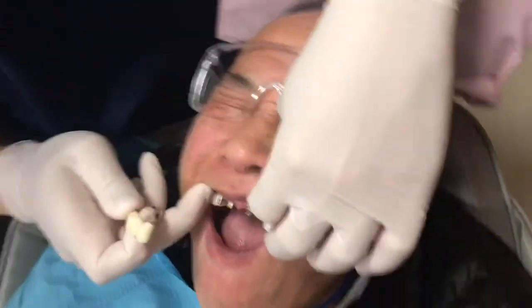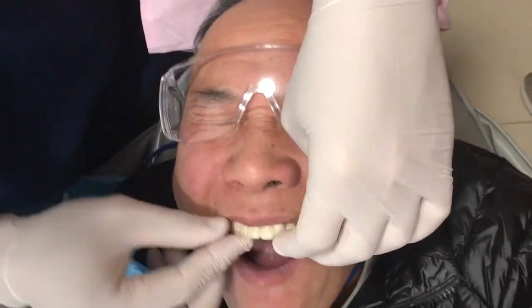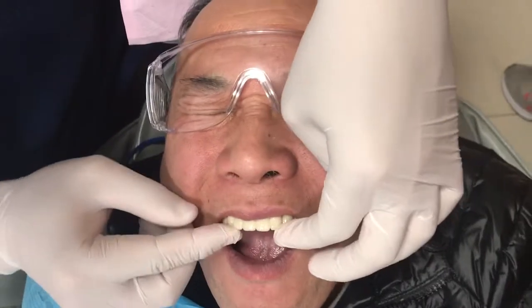Alright, so the back were done last time. Today we're doing the front.